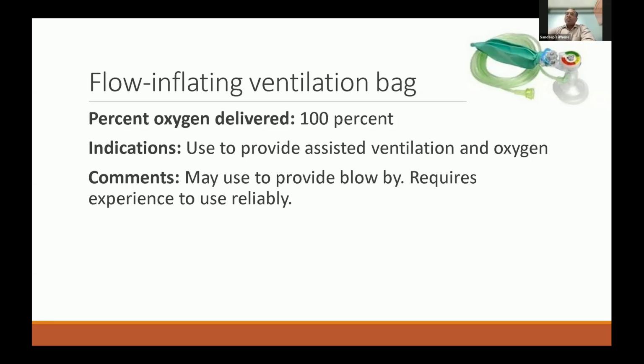Now, when you are using this flow-inflating ventilation bag, you must ensure that your oxygen delivery is proper. Whether you are using it for transport, for OT, or for any other place, oxygen has to be with you always. So this system can also deliver 100% oxygen, right? And it can also ventilate apart from giving oxygenation. It needs a bit of experience to use this system, and the self-inflating bag is very easy to use. Next, please.